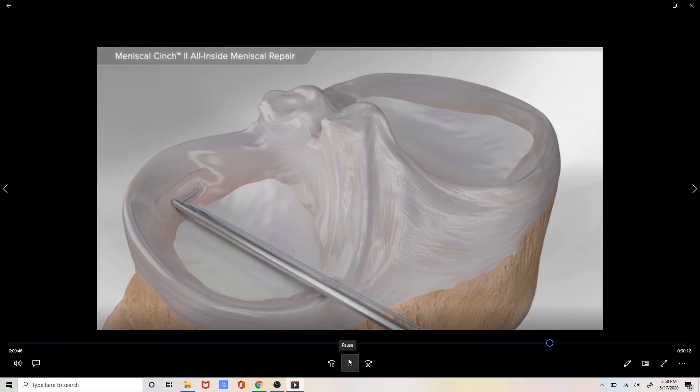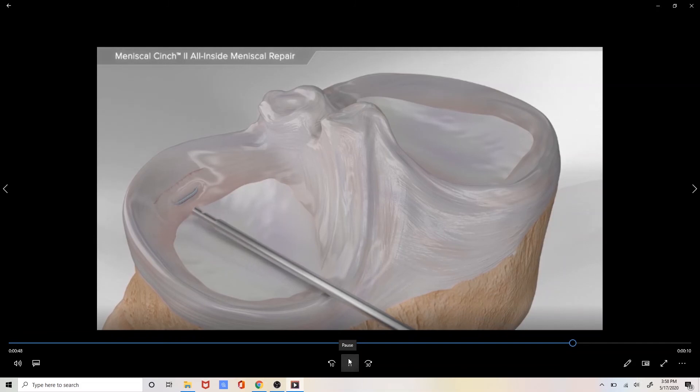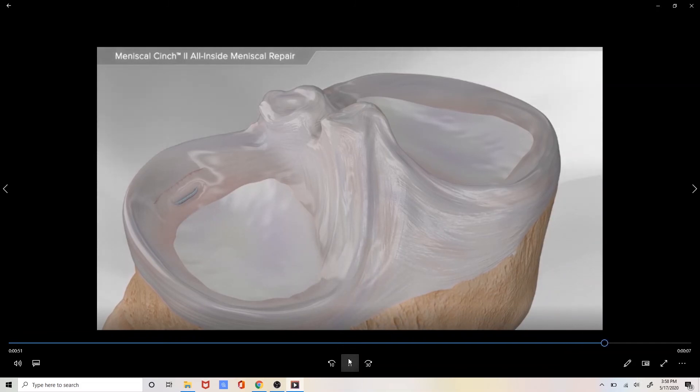The excess suture is then cut and removed and the final repair is seen.